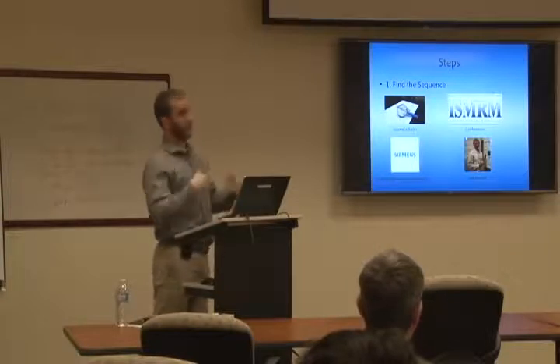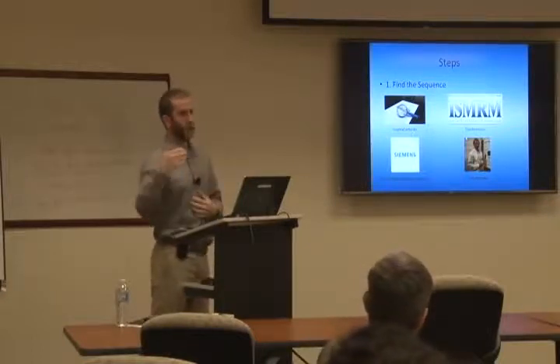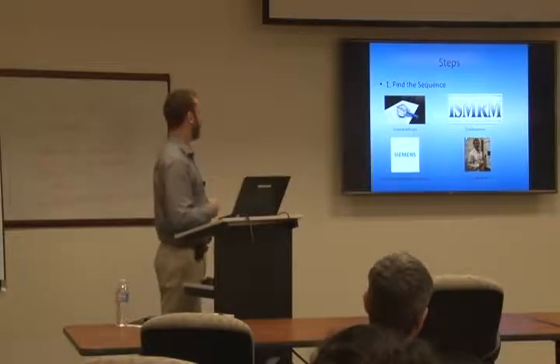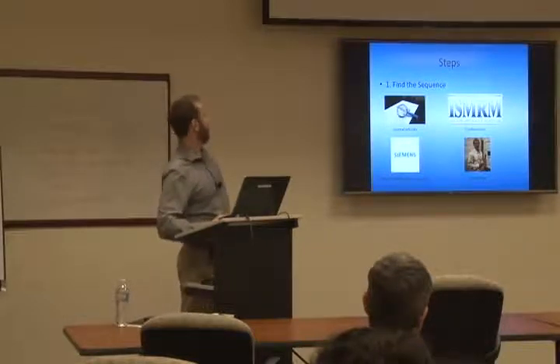It could be a paper on the sequence itself, or it could be someone else that's done an application using the sequence. So sometimes you could contact the people that wrote the paper and say, hey, where did you get that sequence? And you can see if you can bring it over. One of the best resources is this conference here.